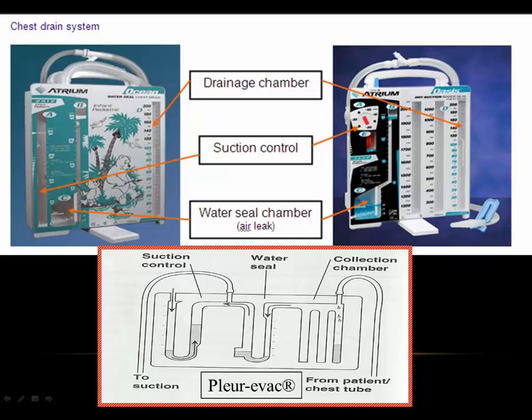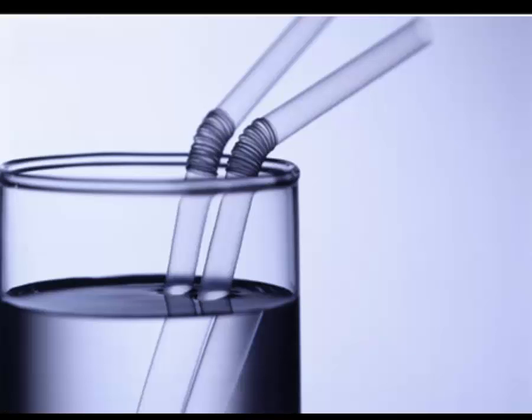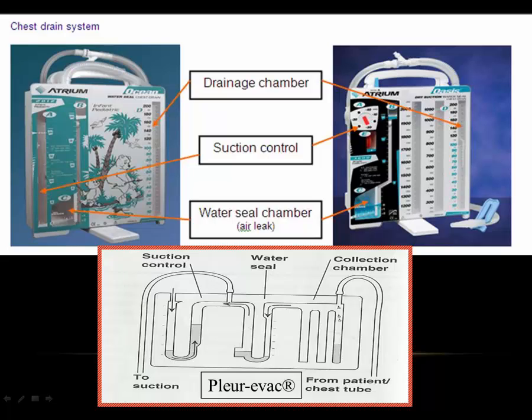An easy way to describe the one-way action of the water seal is to refer to a cup of water and a straw. If one were to blow air into the submerged straw, air would bubble out through the water. Now, if you wanted to draw the air back through the straw, you would only draw water. Hence, when chest drainage came into light many years ago, the one-way action of a water seal, water bottle and straw concept provided a simple but ideal means for evacuating air and not allowing it to return to the patient.